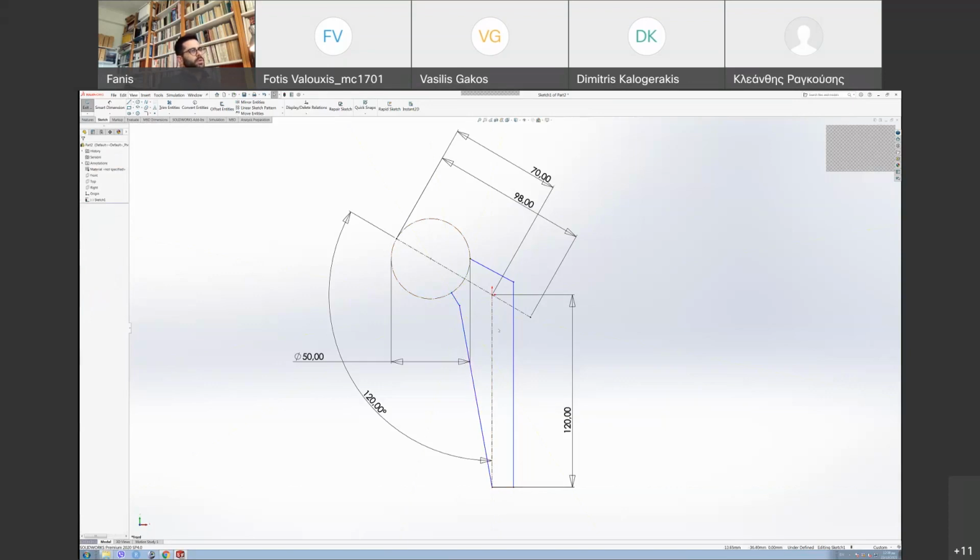And now I'm going to start putting some dimensions here. Again, these are not dimensions that are entirely based on the 3D model. Some of these are just simplifications to make the exercise a bit easier to do. And that's why the 3D model is pretty simplistic.